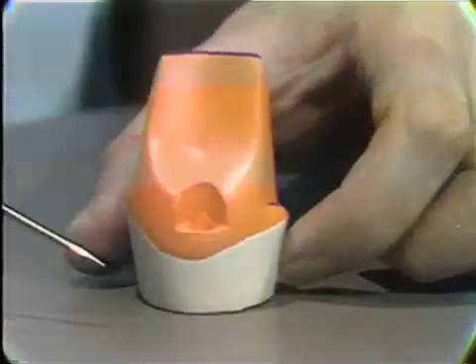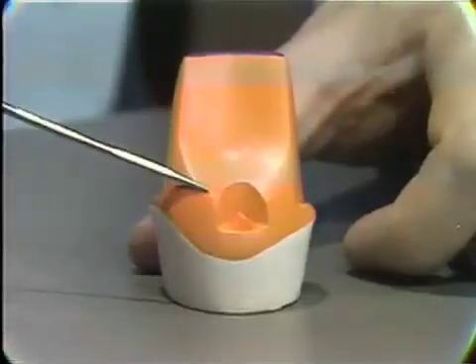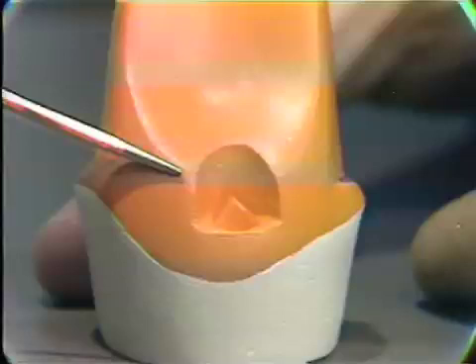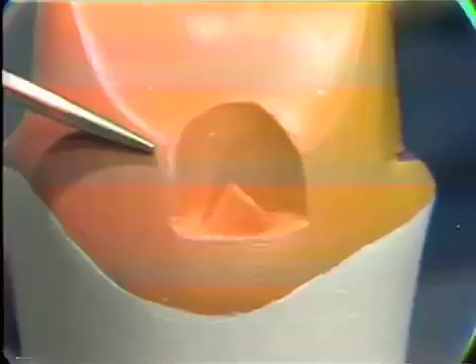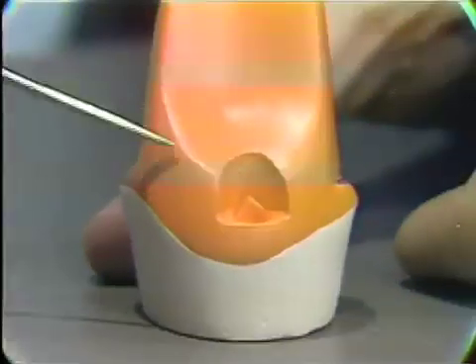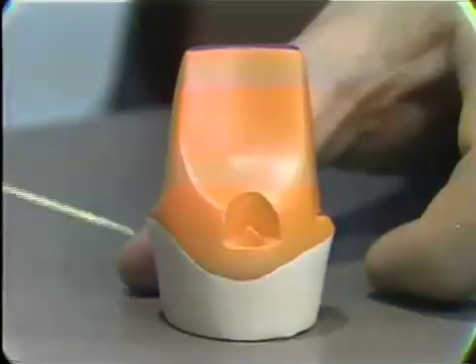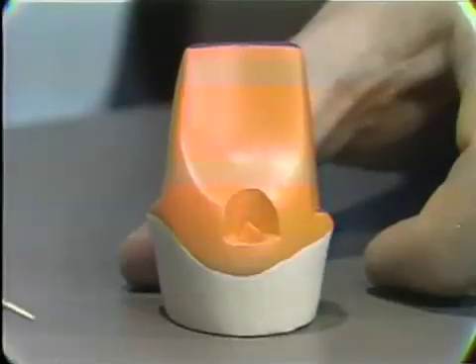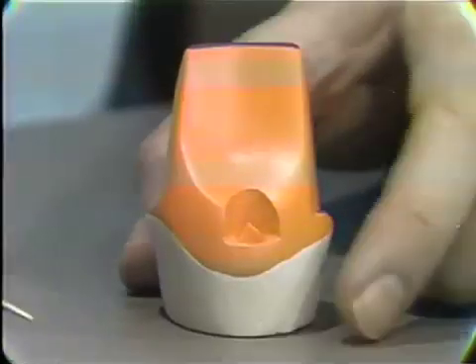Additional retention can be secured by placing a recess and a pin on the cingulum surface, as you see has been done here. And in any case where the crown is perhaps on the short side, or there is some doubt as to the retentive quality and it's being used as a bridge retainer, it is good practice to place a cingulum recess and a pin to ensure adequate retention.